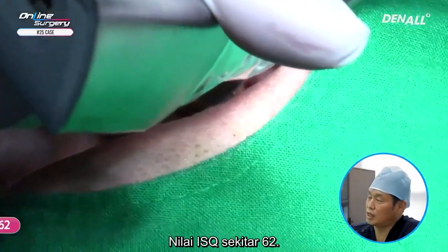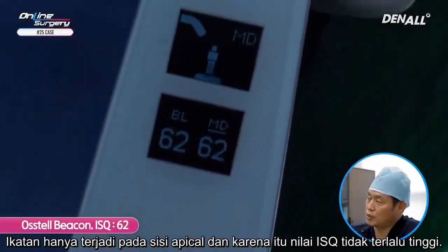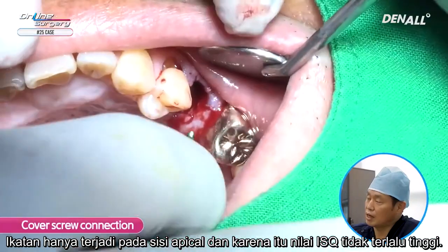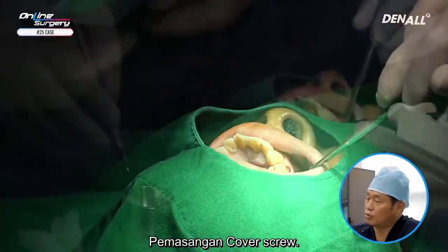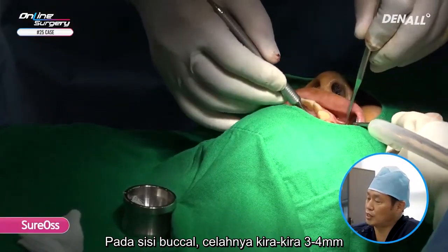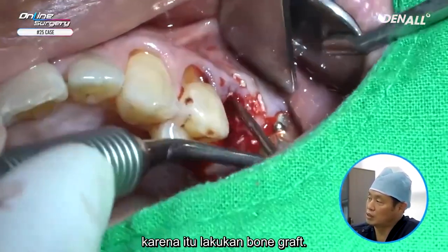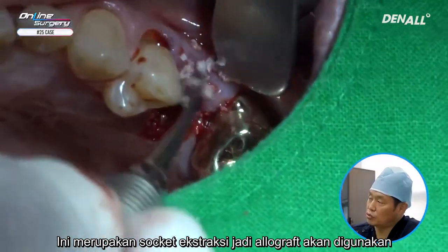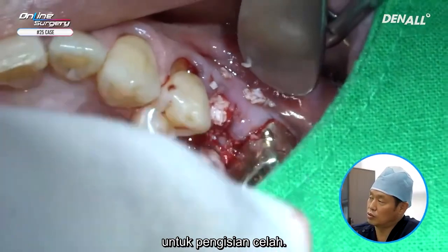The ISQ value is approximately 62. There's only engagement in the apical side, and therefore the ISQ value is not very high. The cover screw is connected. On the buccal side, the gap is approximately 3 to 4 millimeters, and therefore bone graft is going to be done. The gap is quite significant. This is the extraction socket, so allograft is going to be used for gap filling.